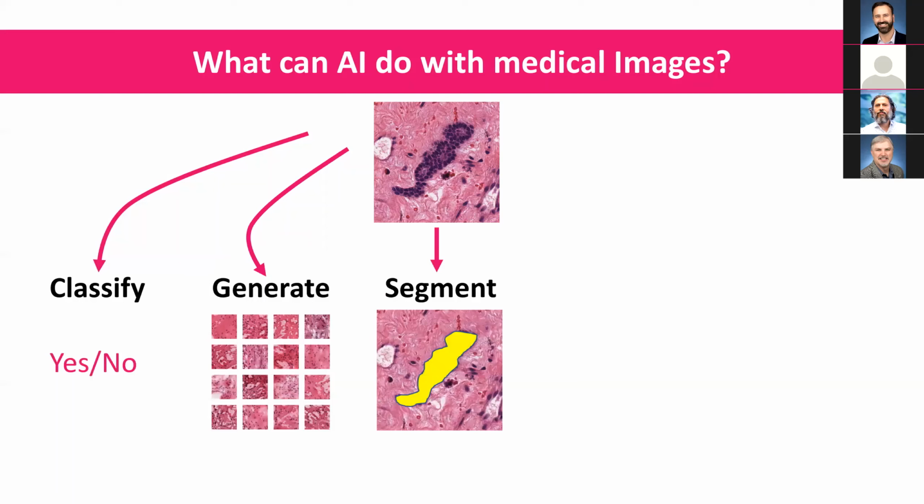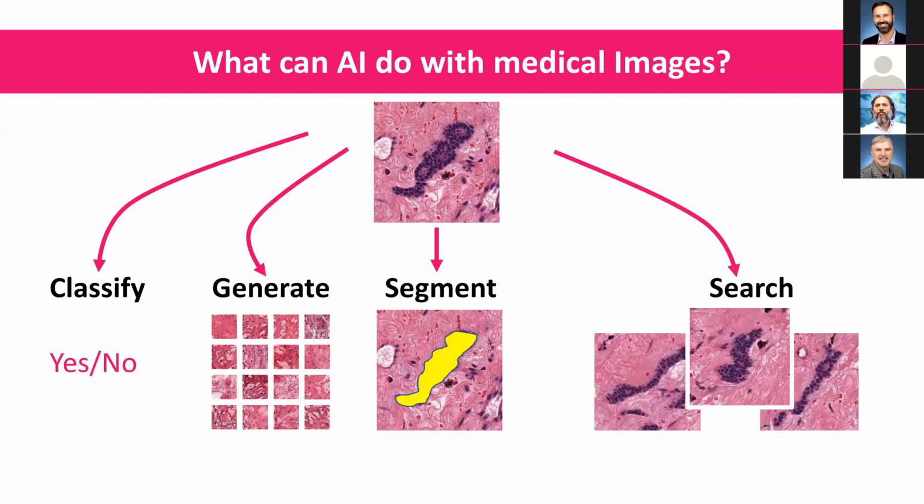Of course, traditionally, segmenting structures in histopathology images is a conventional task. And our interest is search. You can search for similar structures in large archives.